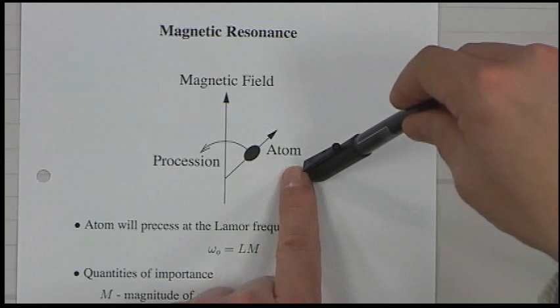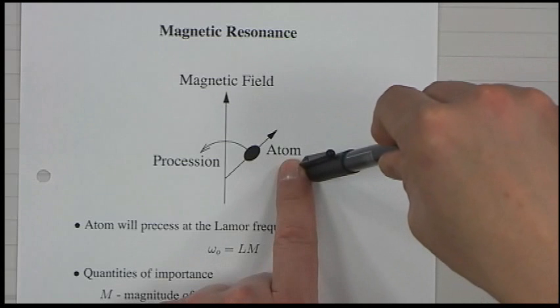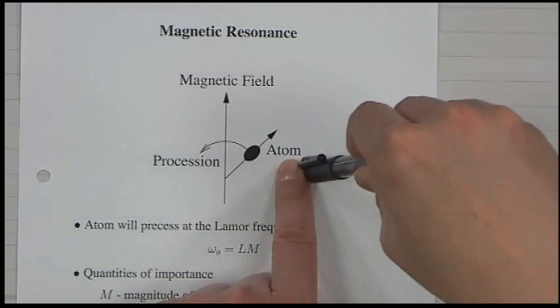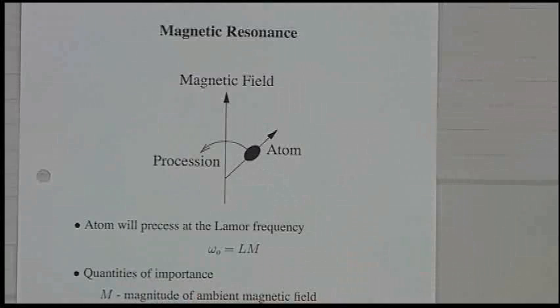So typically, imaging with MR is done with hydrogen, although it doesn't have to be. But most MR scanners are designed to image hydrogen, so all the center frequencies and everything are set up for hydrogen. And I should write down every year, I threaten to write down what the frequencies are. So it's something like 43 megahertz or something like this.